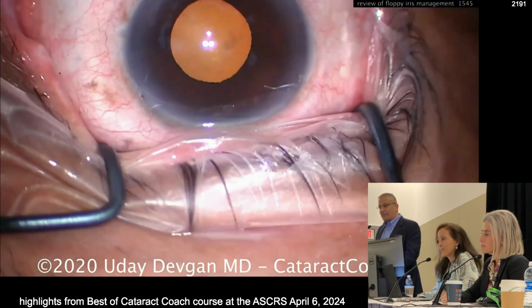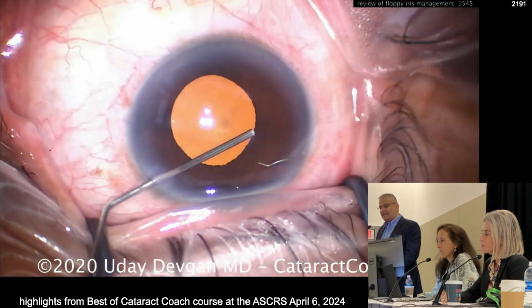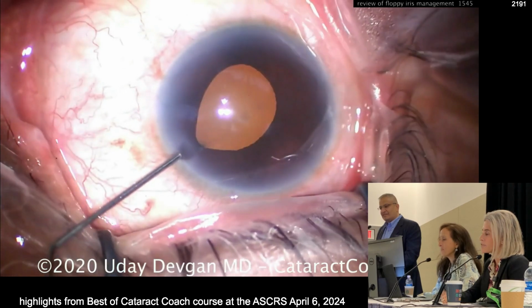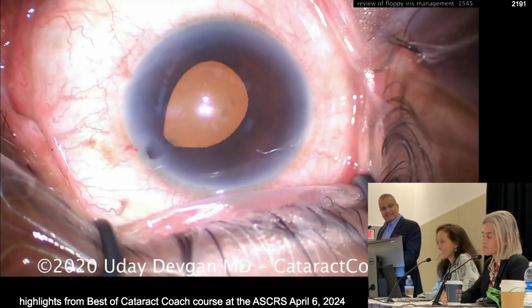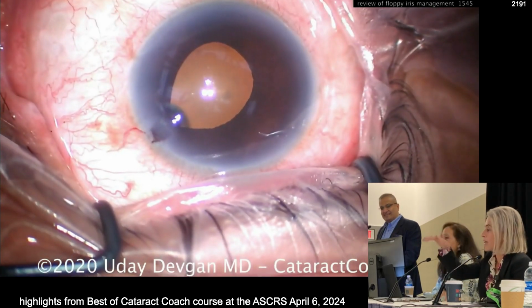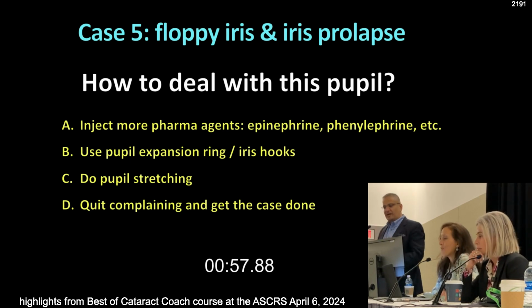Look at this case. I make a para. As soon as I make a para, I'll inject some anesthetic and some phenylephrine and some epinephrine, and look what happens. Oh, yeah. This is a Flomax iris. Yes, absolutely. 100%. How could you tell right away? Because of what it did right there. And the waves, when you inject, it's all those little waves that occur. So what do I do now? Inject more agents? Flappy. Pupil expansion ring, hooks, pupil stretching, quit complaining, get the case done.